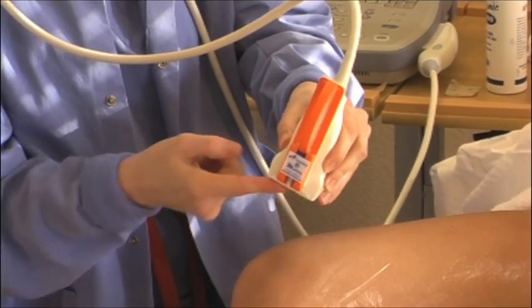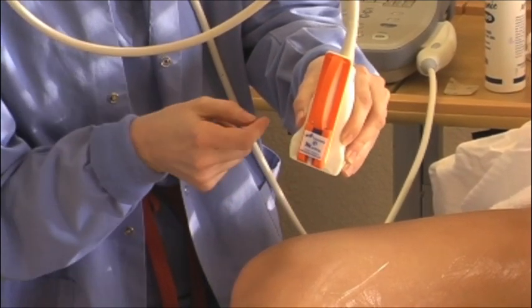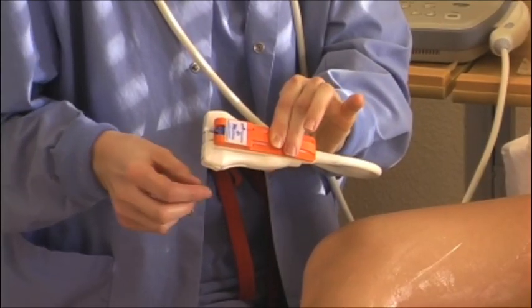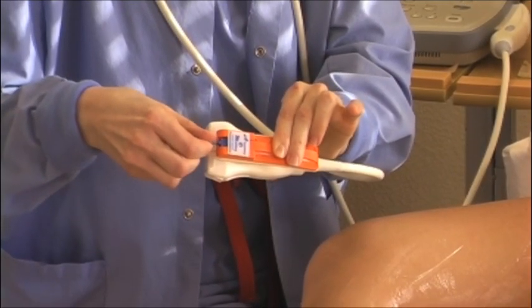This demonstrates the optimal application of the AIM device. Depress the actuator and remove the ink cap by twisting it.